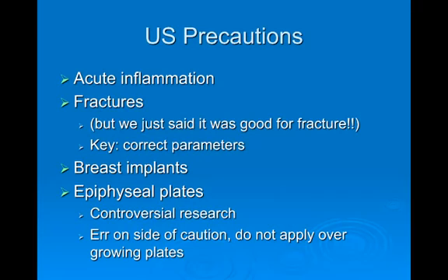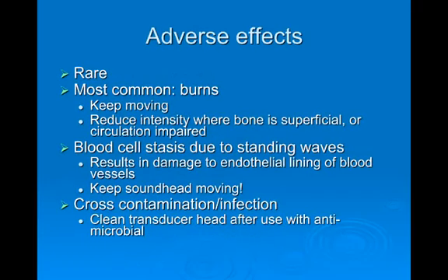Okay, so it's been shown to explode breast implants, so we'll stay away from that. And then epiphyseal plates. Okay, here again, controversial research. We're probably not affecting epiphyseal plates, but obviously, this is in children whose plates have not fused. That's what we're talking about here. But research is very plus minus on this, so definitely err on the side of caution. Don't apply it over the growing plates. That would be your best advice there.